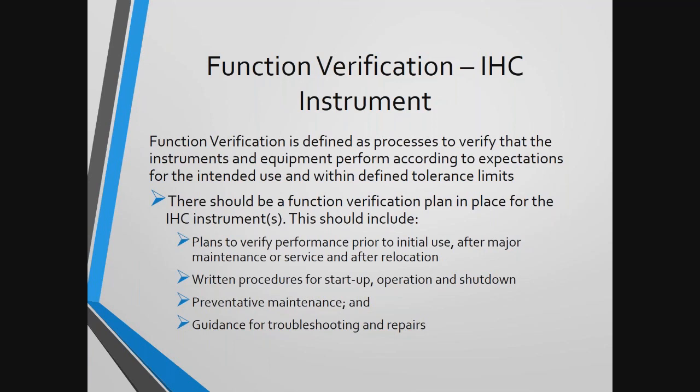Your plan for function verification should be imposed when you first implement the equipment in your department, anytime you move the equipment, and then anytime there is major maintenance performed on the equipment. These are events that could have a negative impact on the way the equipment functions and therefore require you to take steps to ensure appropriate and expected behavior after they occur.